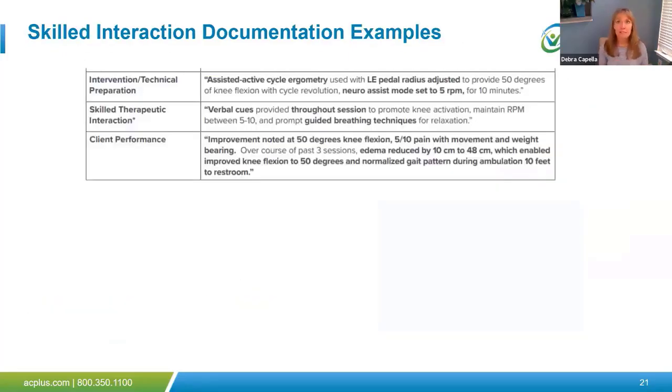As I've sort of been discussing with you, the OmniCycle is not just something to take up time in the therapy session. It is a purposeful exercise with a lot of thought behind the choices that the therapist is making, and a lot of monitoring and cueing and assisting from the perspective of the biofeedback is going to be happening during that session. So we want to make sure we're documenting it and giving a good sense of what was happening and why we chose what we chose.